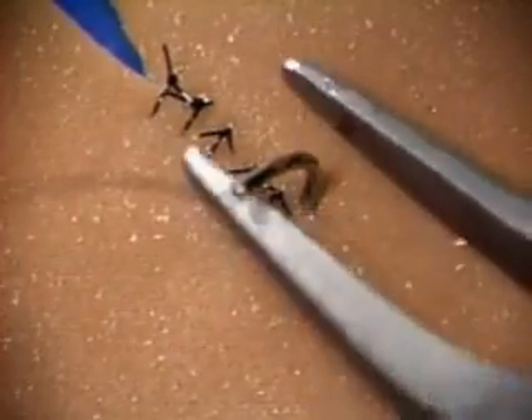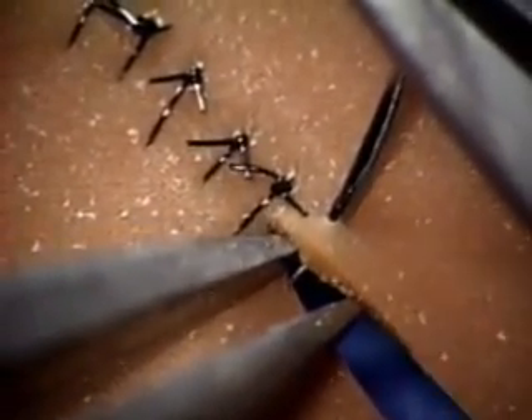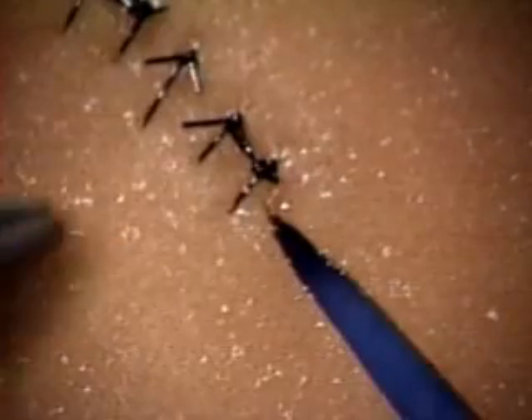Remember: don't let go of the needle between going in and coming out. If you do, your efforts to regain control will likely lead to a struggle, and in delicate vessel tissue that can enlarge the needle hole. Regarding tissue handling with your left hand forceps: using the left hand forceps as a counter-presser is a nice atraumatic method which is strongly recommended. Two other useful methods in vessel surgery are picking up the adjoining stitch and picking up the outer layer of the tissue.